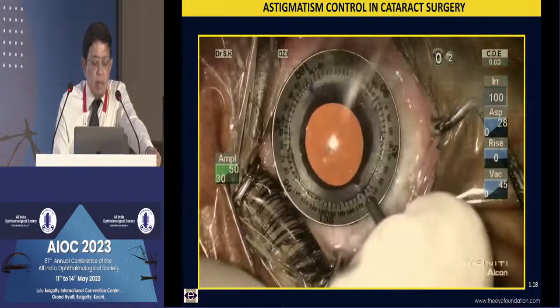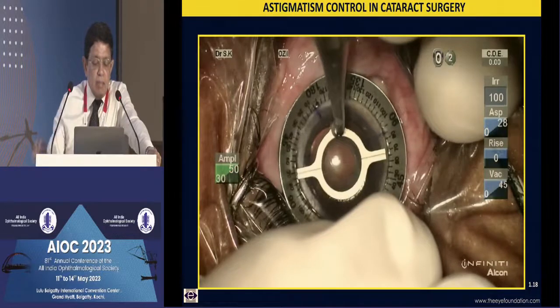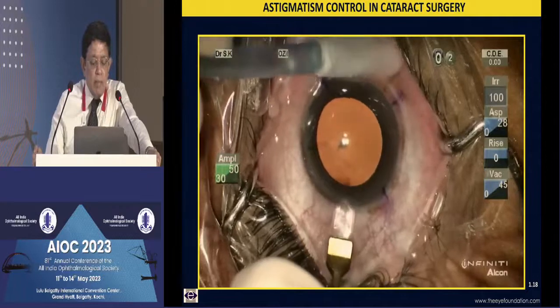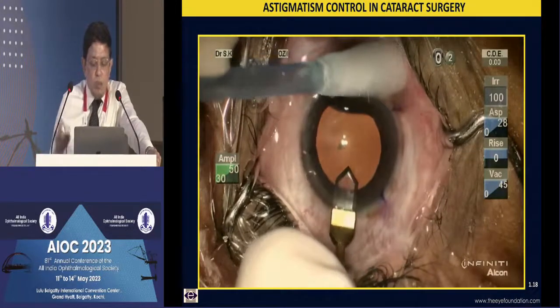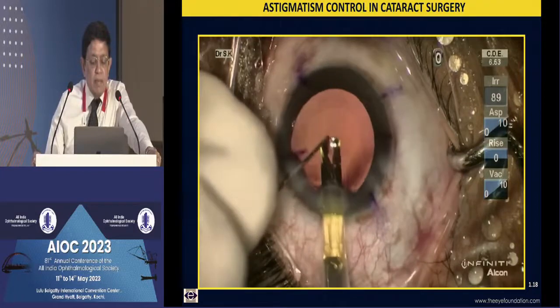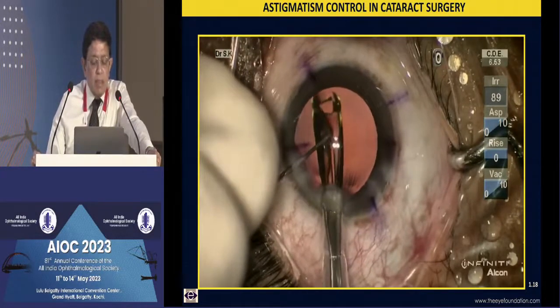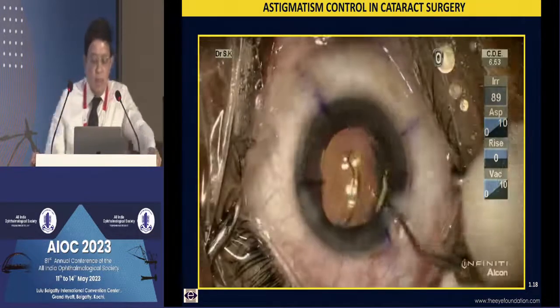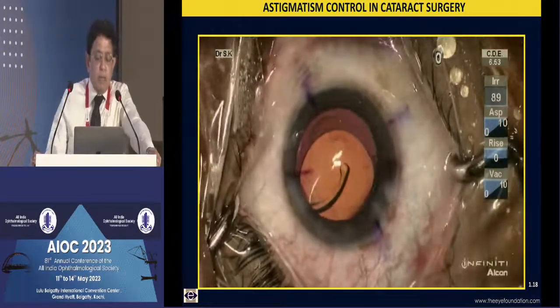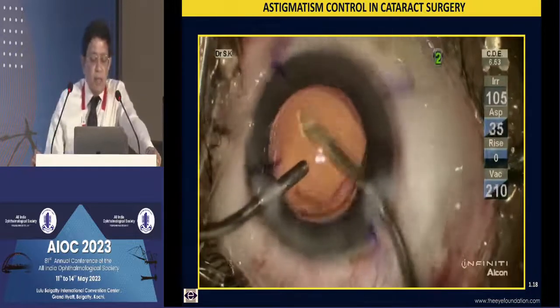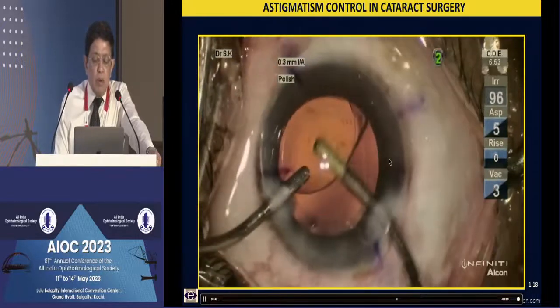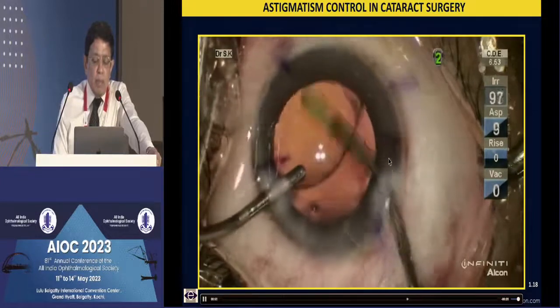Here is a video of a toric implant. I am not using a digital overlay system here — that is the Mendel's ring showing the orientation of the IOL. I am making a 2.4 millimeter incision. The toric IOL is being placed under viscoelastic. It is extremely important that at the end of surgery the viscoelastic is completely evacuated. You rotate the lens and position it so that you need about 5–10 degrees of rotation for final orientation. These are the marks along which the lens has to be oriented.